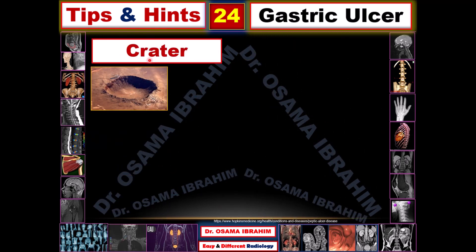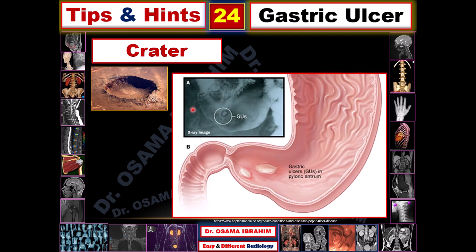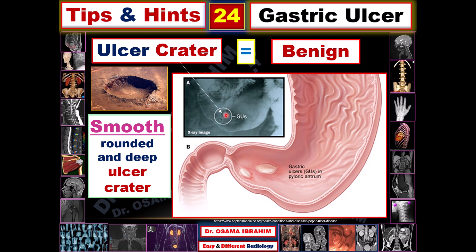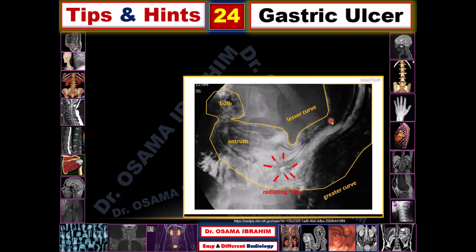The second feature of a benign ulcer is the crater. The crater appears as an opening or hole in the surface. Here we see two gastric ulcers in the antrum, forming craters — holes in the surface filled with contrast, with surrounding edema of the wall appearing lucent around the crater. A smooth, rounded and deep ulcer crater is a feature of benign gastric ulcer.